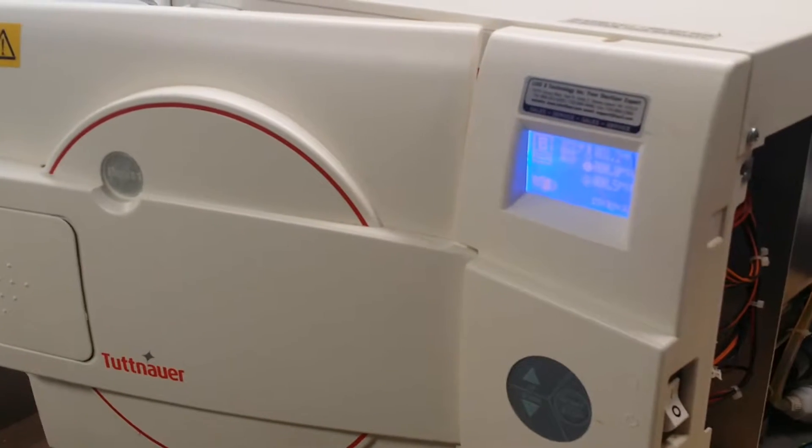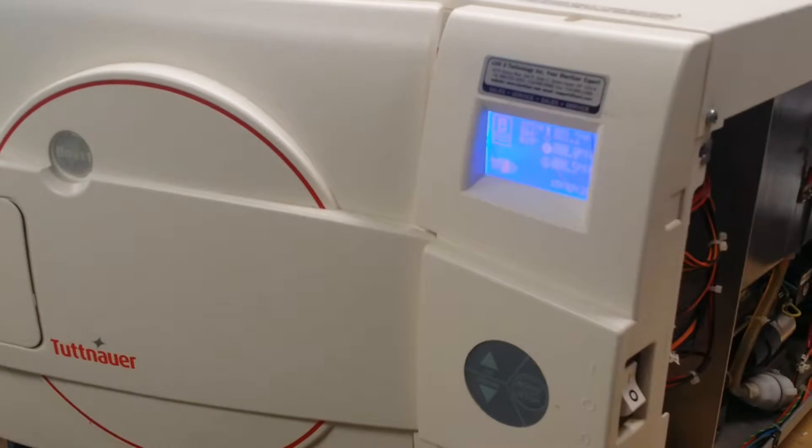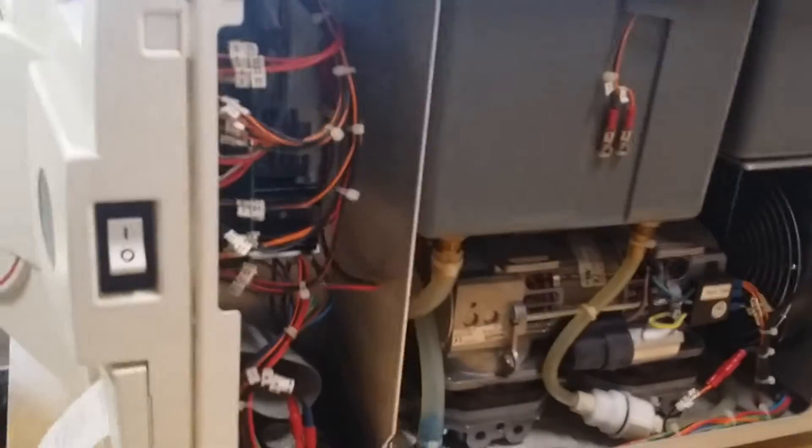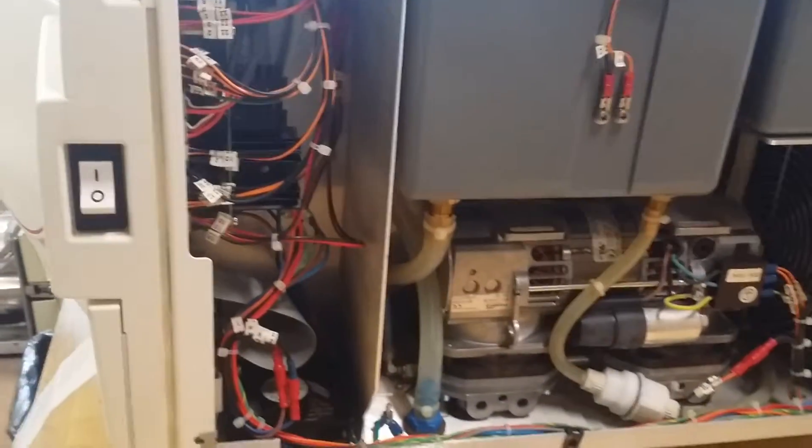The Tudna Ilala sterilizer is very advanced, very good sterilizer. It's a class B, which means it's a preheat, pre-vacuum sterilizer. So it will be very fast to finish the cycle.